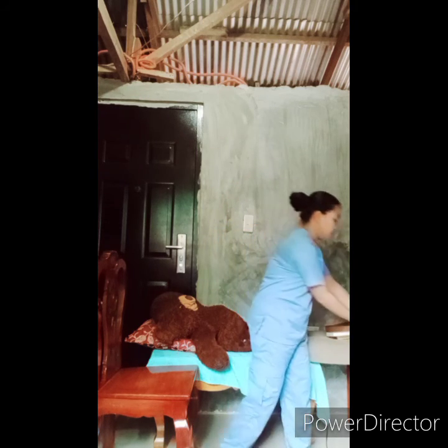And then next is let's perform hand hygiene. And then next, let's monitor the vital signs. Let's ask the patient if she feels dizzy or fatigued. Let's note the patient's behavior and response to the transfer. And then let's perform hand hygiene again, and let's document the patient's ability to tolerate transfer. So now I am done performing the wheelchair transfer technique using pivot technique and board technique.